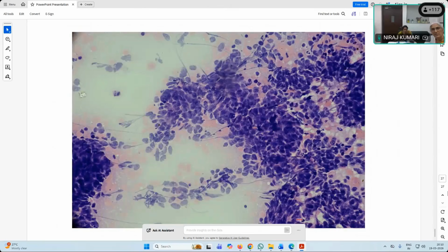So molding is something where the nuclei are opposed to each other and they are so fragile and so adjustable that they can fit according to the surface. Imagine putting something flexible into a small box. They have this kind of border which is opposed to each other.